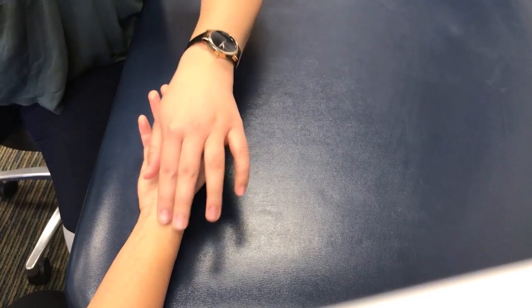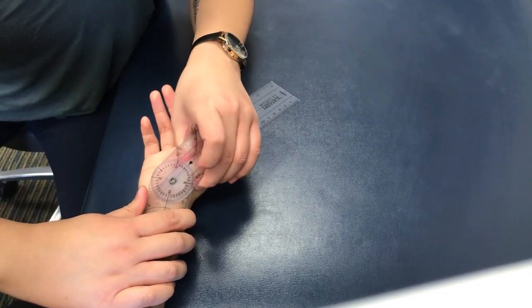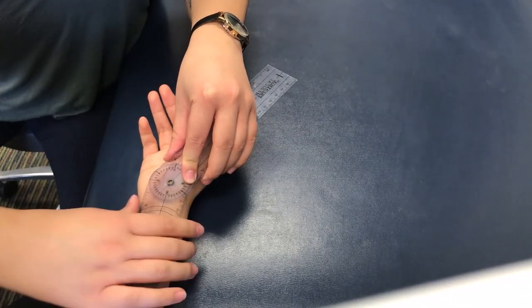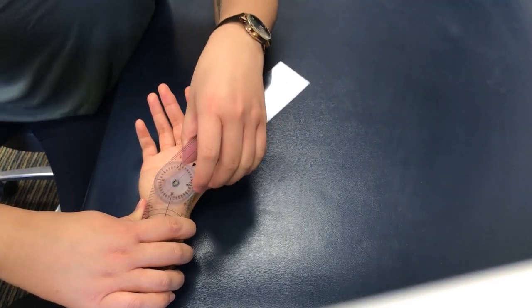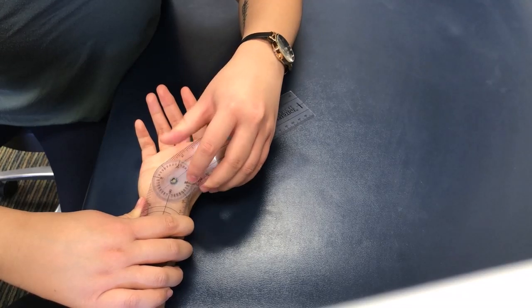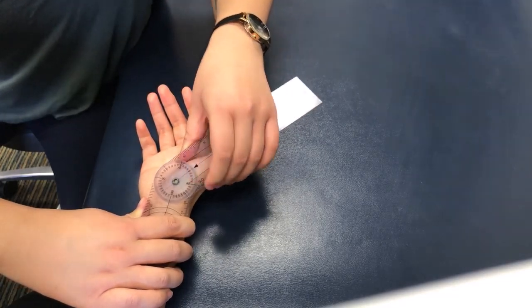For thumb CMC extension, the patient position and the landmarks are the same. So again, starting at 30 degrees. And then for active range of motion, you're going to bring the thumb away from your palm. So the difference between 30 and the measurement now, which is 38, is 8 degrees.